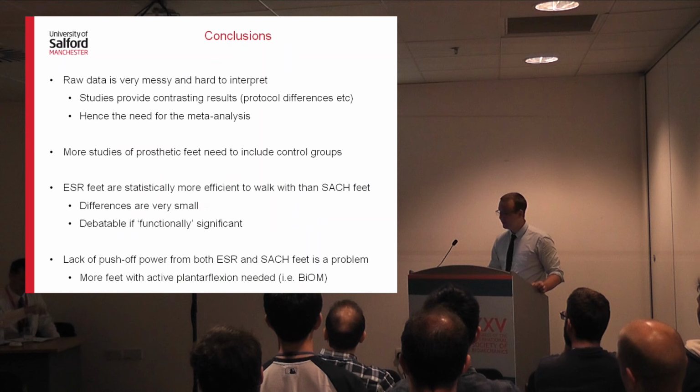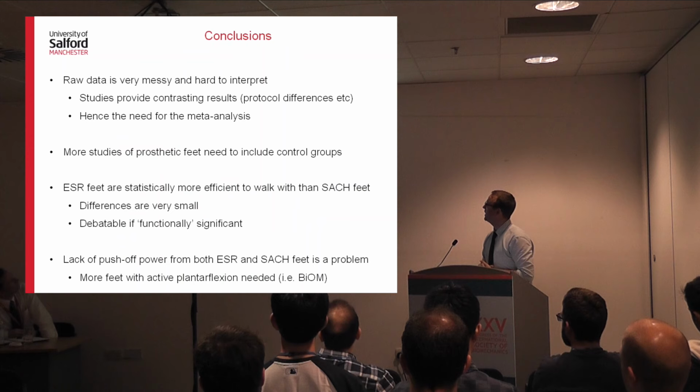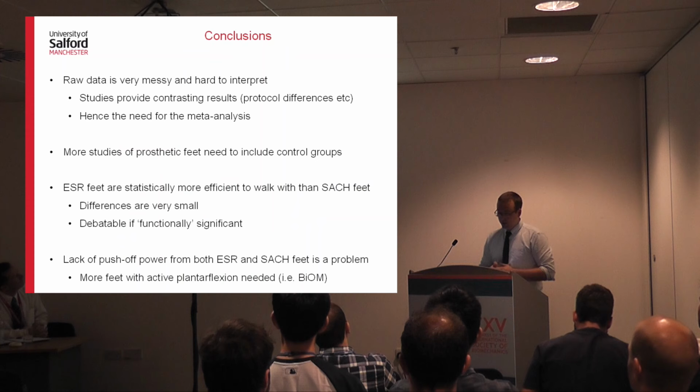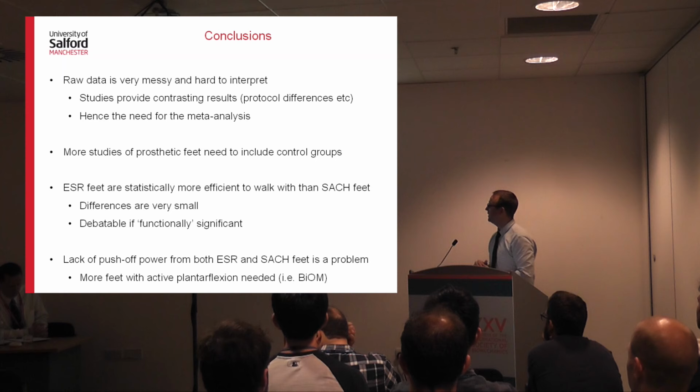The raw data, if you just look at it as it is, is very messy and it's difficult to interpret. Studies tend to provide contrasting results, and that's due to protocol differences, low subject numbers, hence the need for the meta-analysis we conducted. More studies of prosthetic feet, I think, need to include control groups, non-amputee control groups, so that we can actually compare how these prosthetic feet are performing to non-amputees. ESR feet are statistically more efficient to walk with than SACH feet.